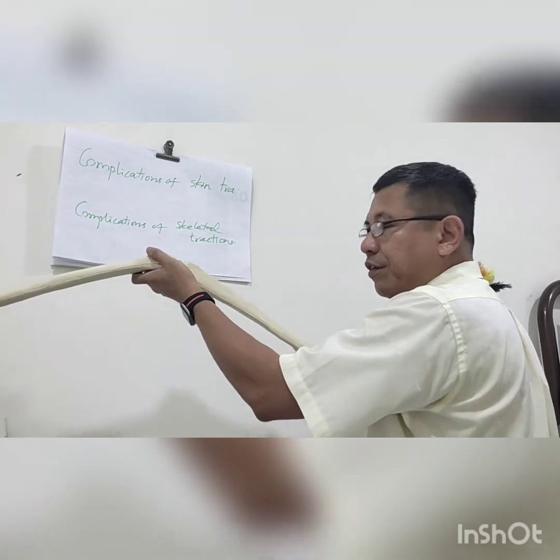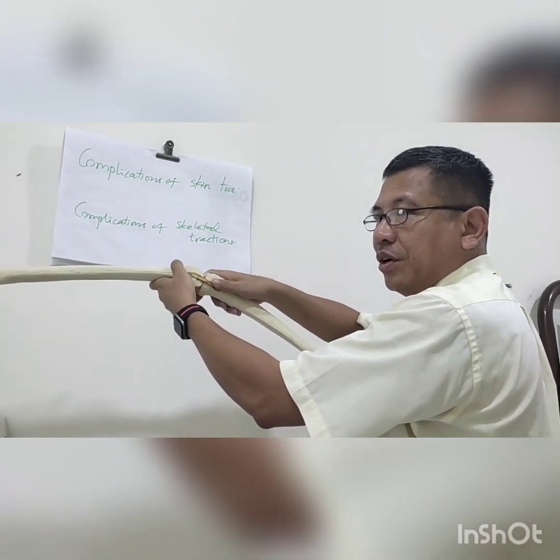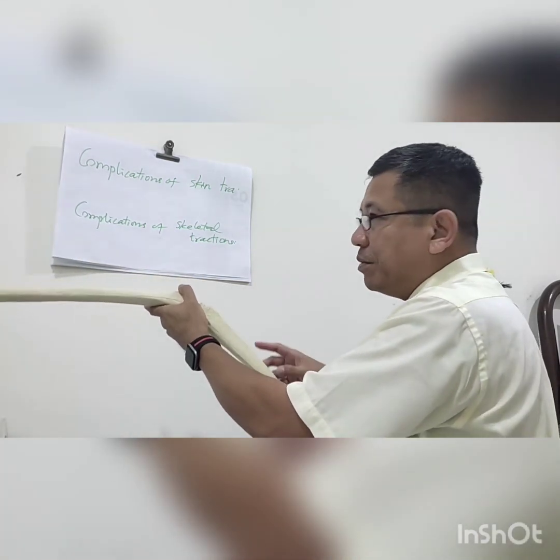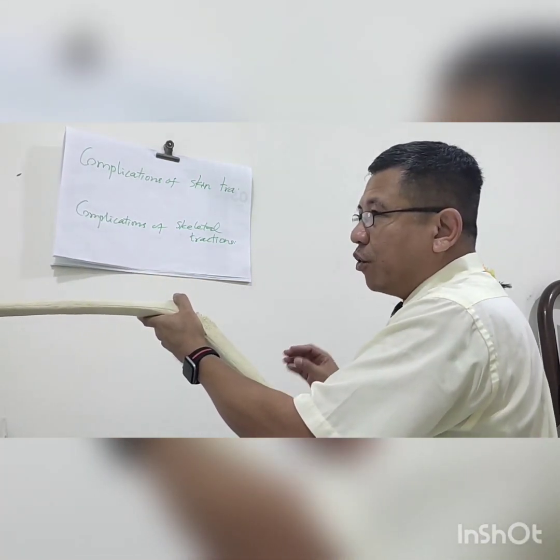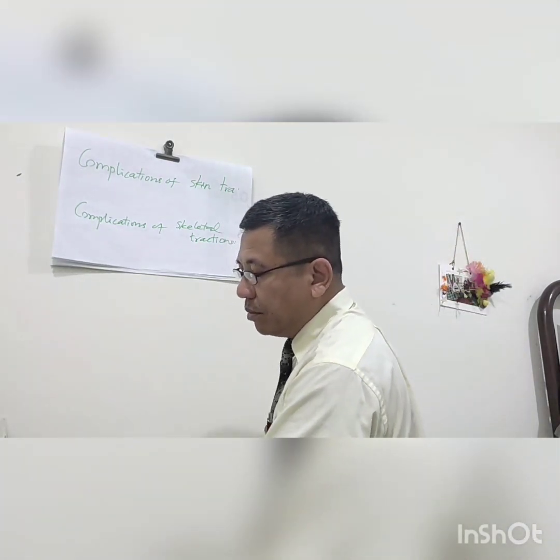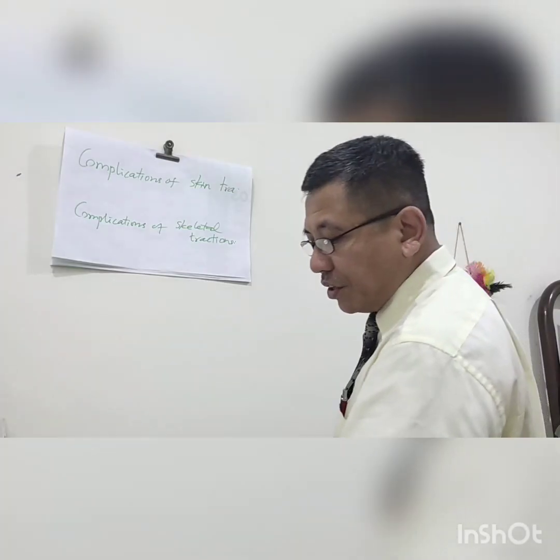If you apply very heavy weight, there may be ligament injury. If you put heavy weight in a pediatric patient, there may be epiphyseal growth plate separation. So please take care of the complications of skeletal traction.